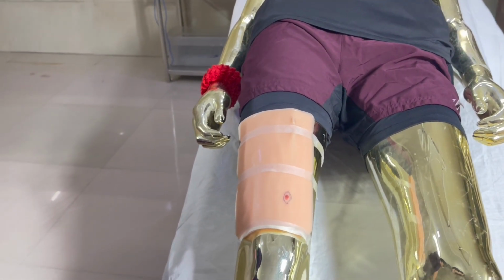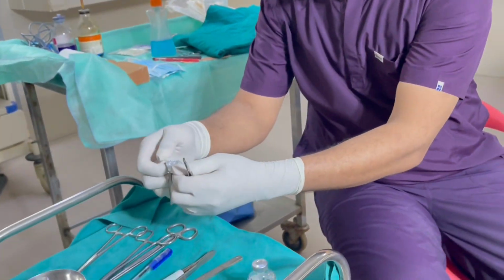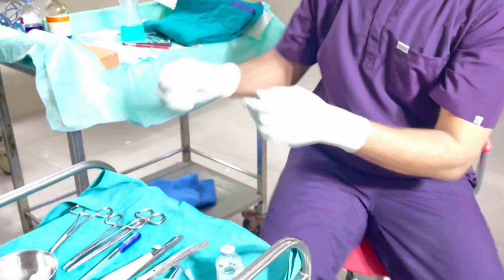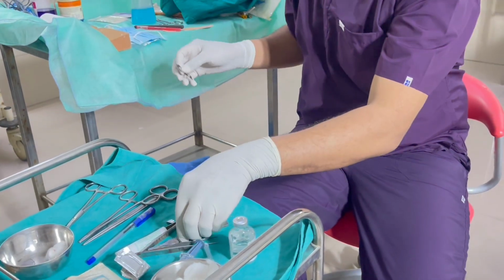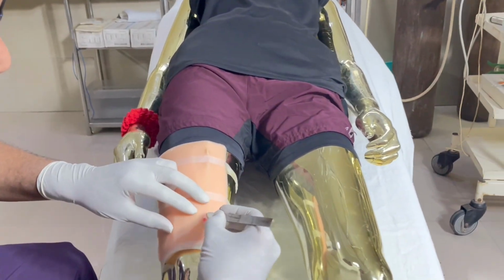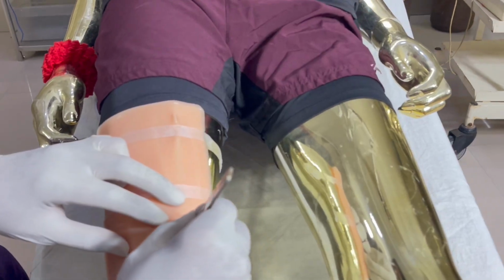If the scalpel blade is already there, these are sometimes the different types of blades. I will just try to apply it on the ready-made. Actually this is ready-made, so this is the blade. I am going to excise in this way.